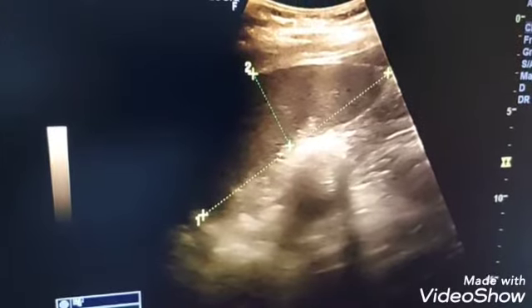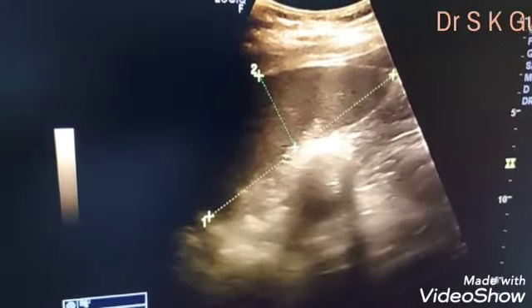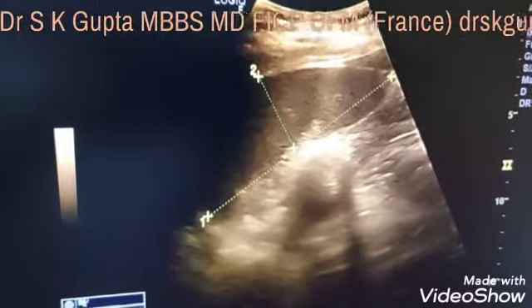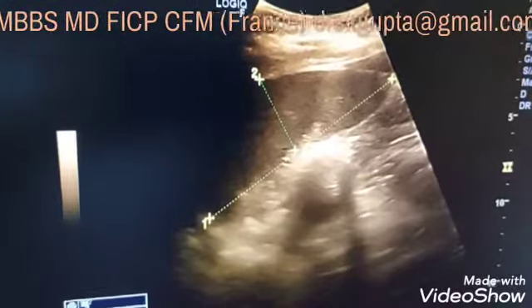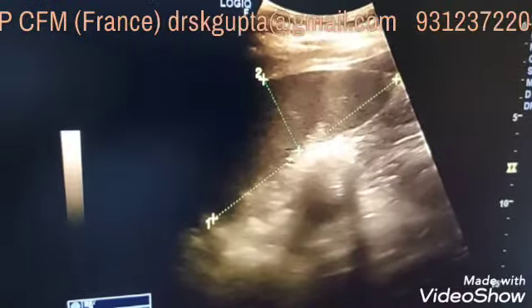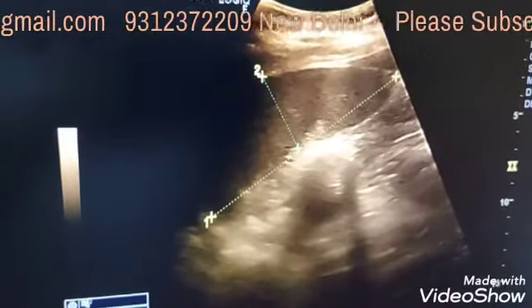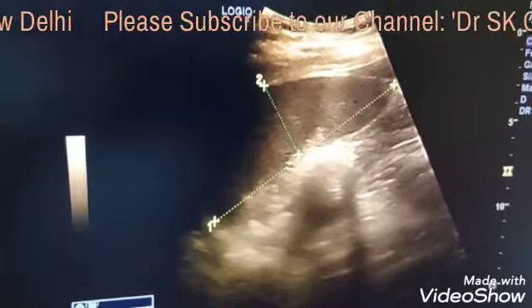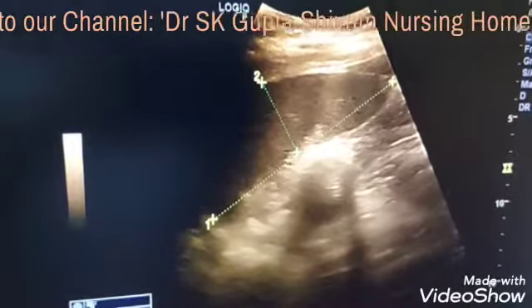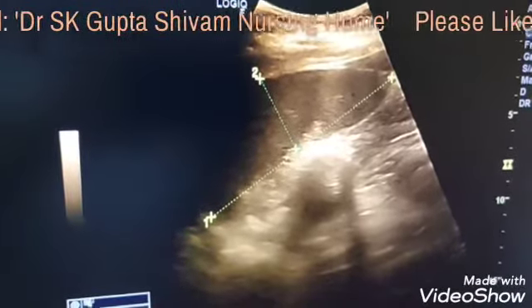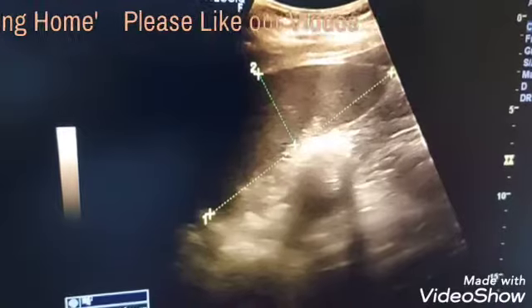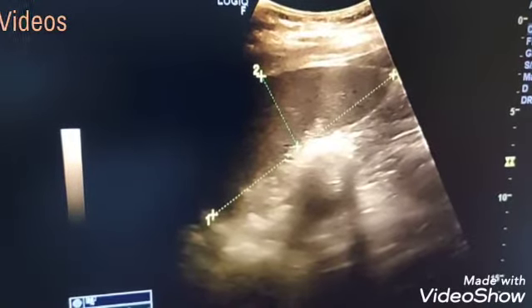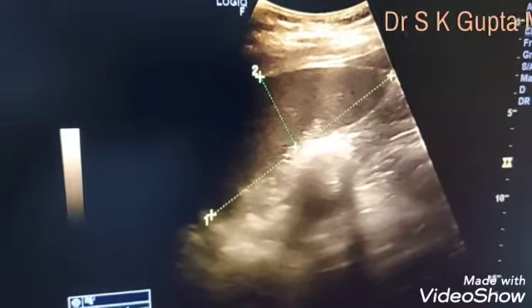When it fuses with the opposite kidney, it is called crossed fused ectopia. When it remains on the same ipsilateral side but does not reach its normal position — either going above into the thorax, or remaining lower in the abdomen or in the pelvis — then it is called ipsilateral ectopia, as we have seen in this patient.